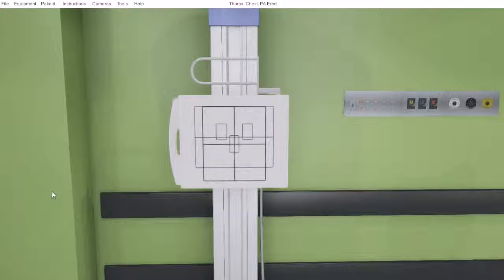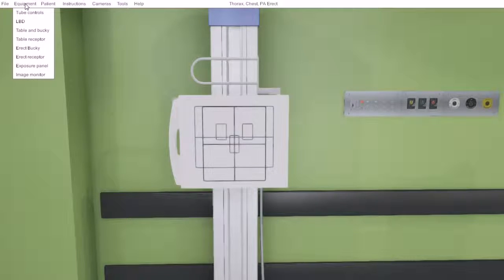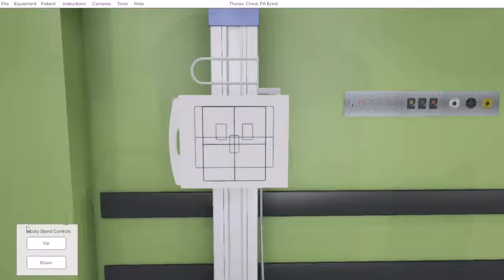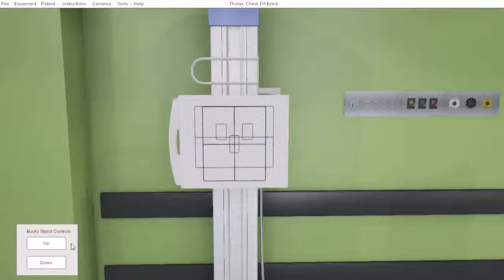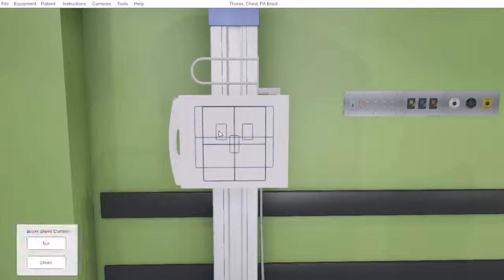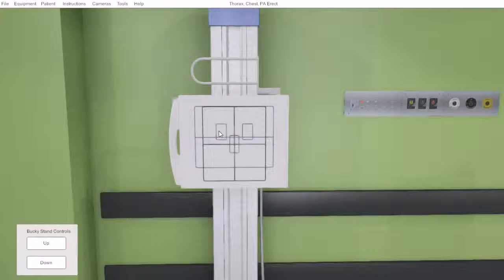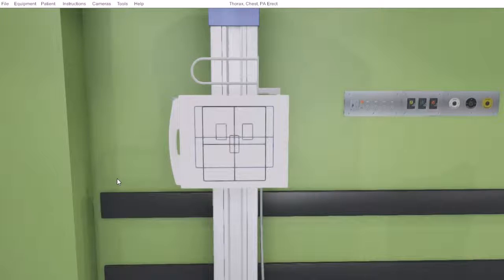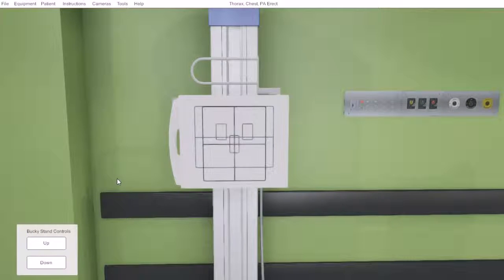When wishing to interact with our erect bucky, under equipment you will see the erect bucky, where we are allowed access to our stand controls. This access can also be gained by touching the front of our bucky, or numerical key value 5.